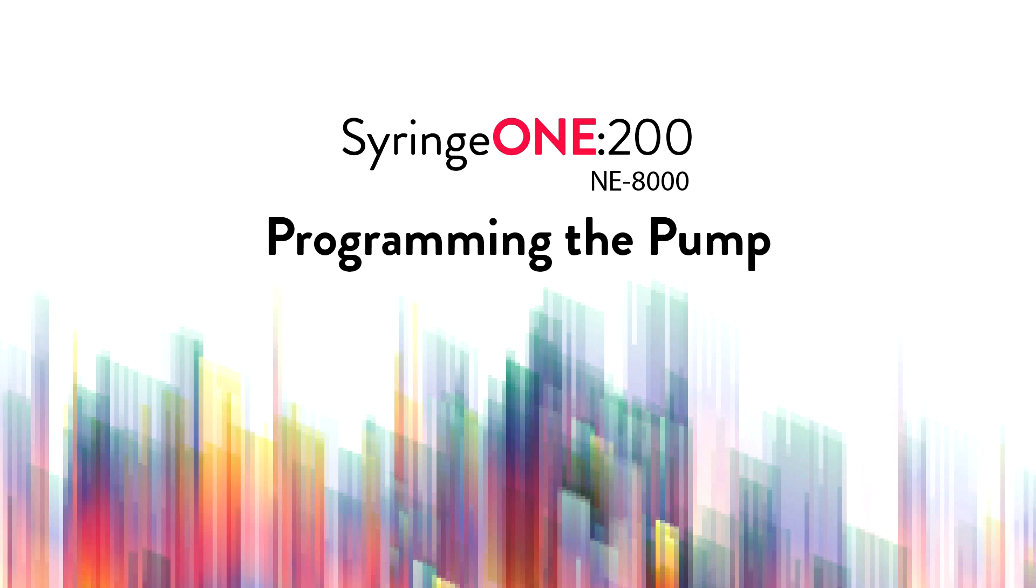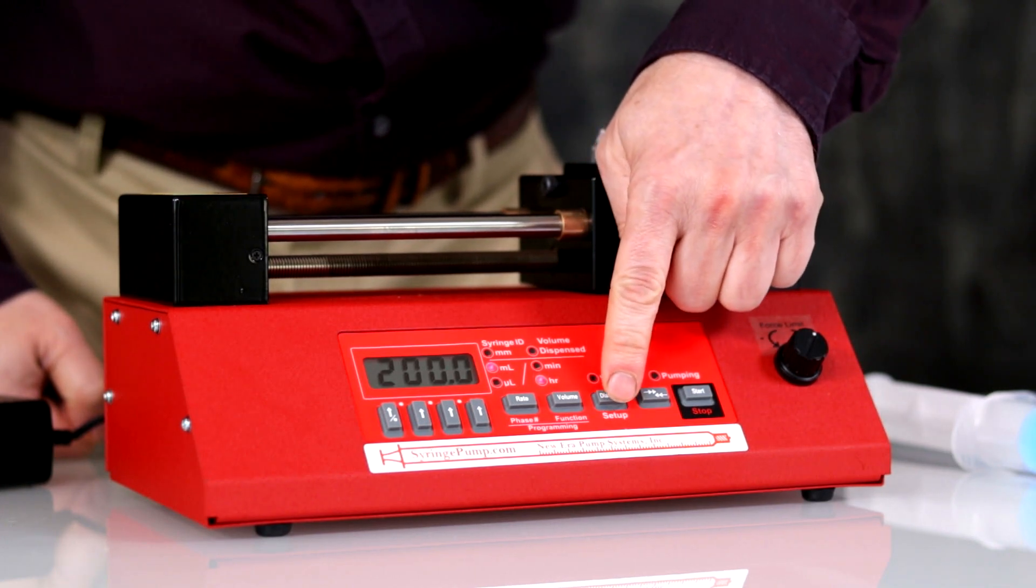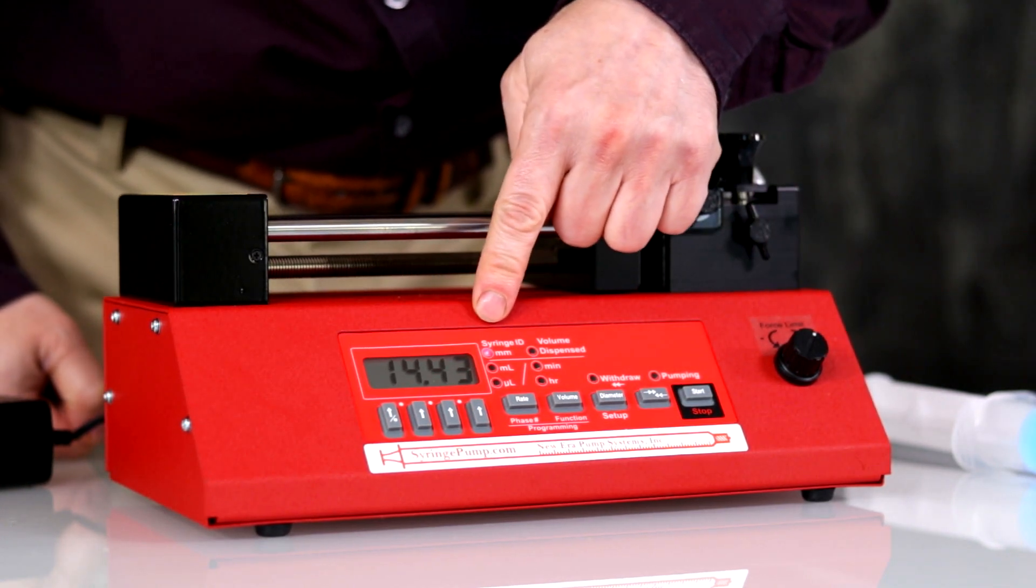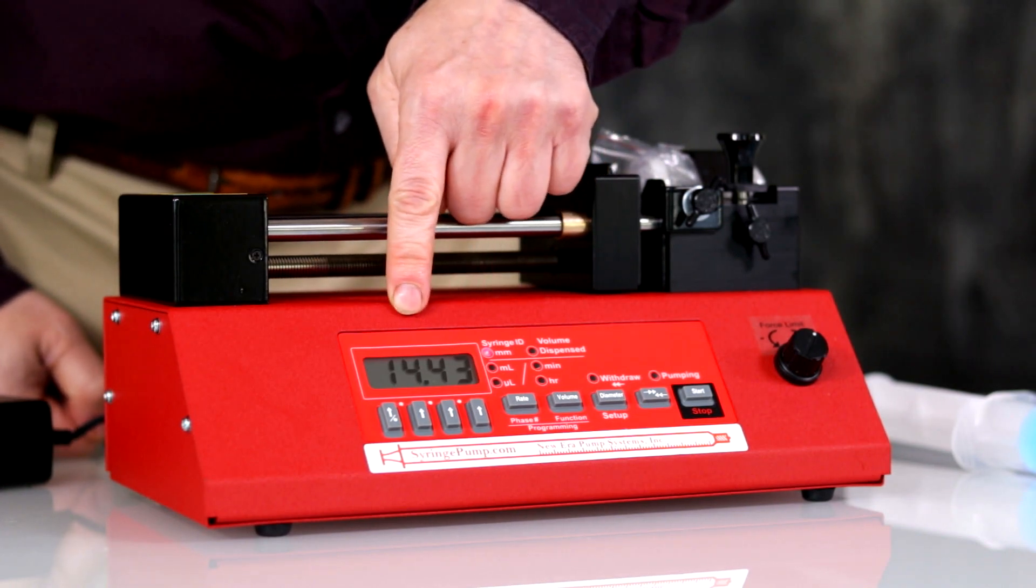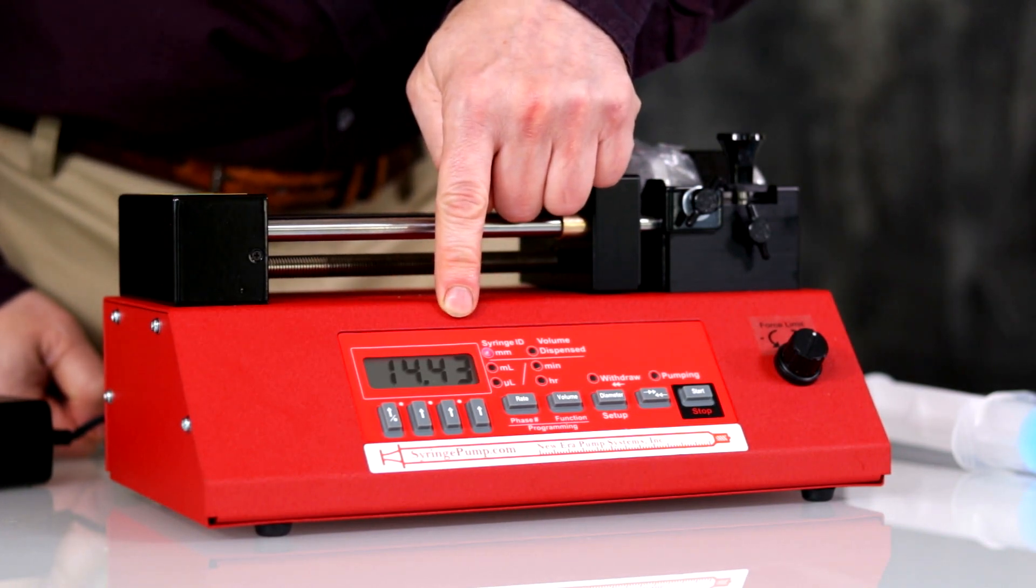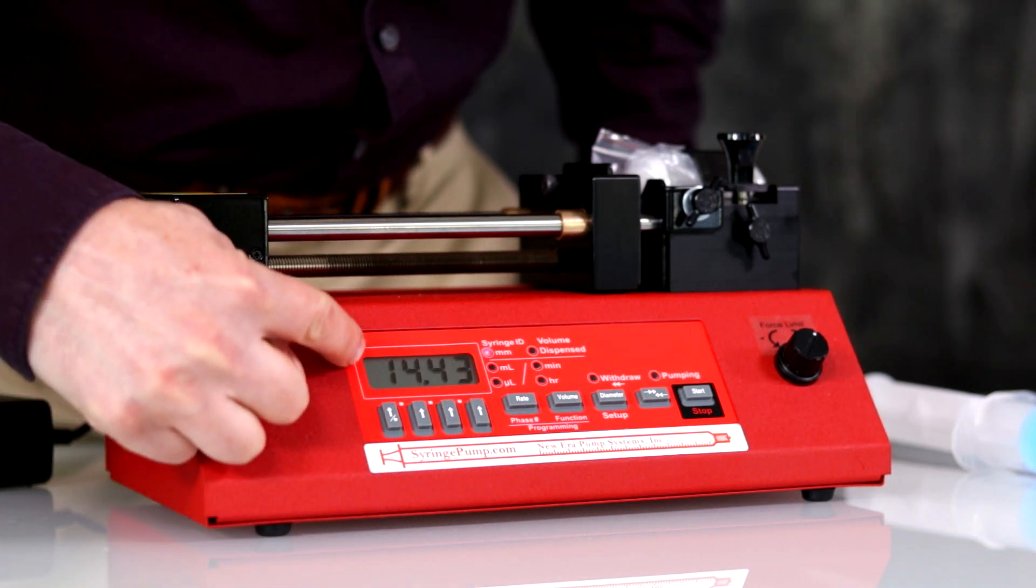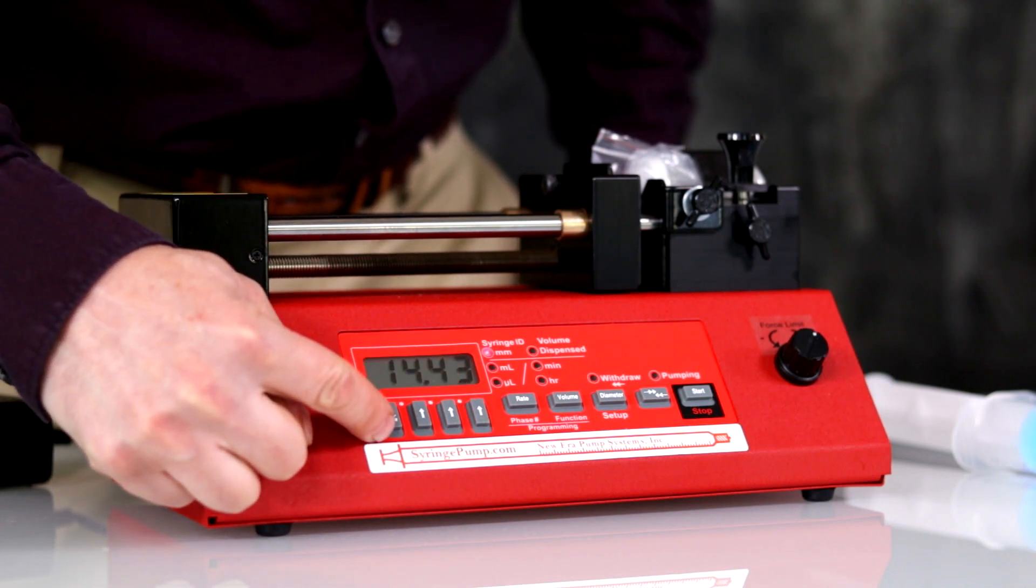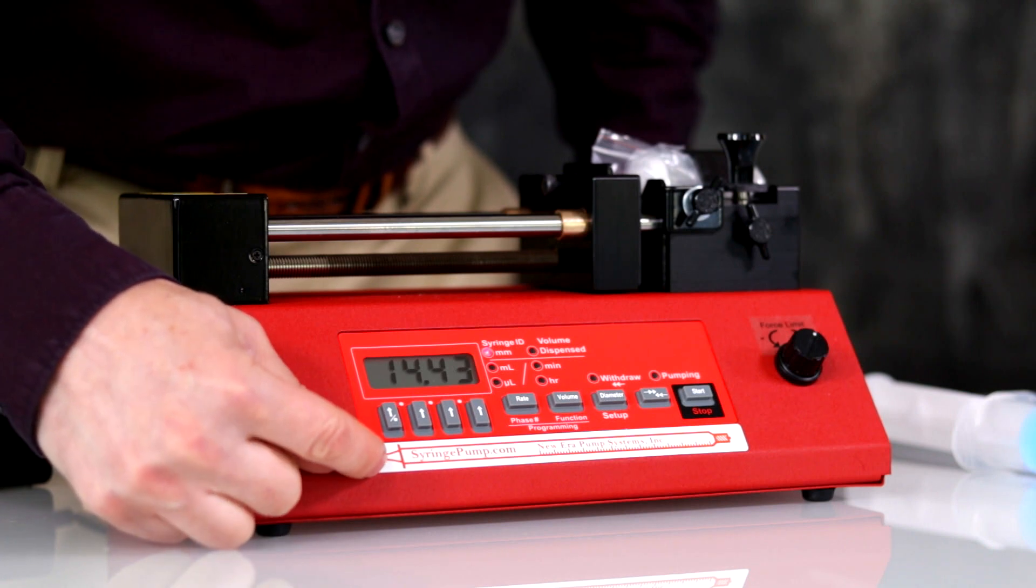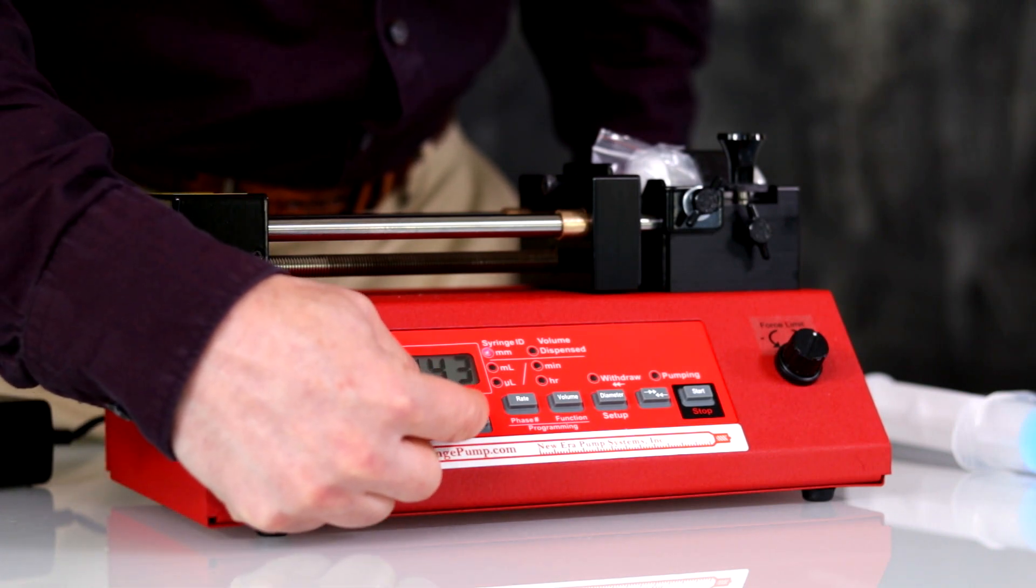NE-8000 programming the pump. To program the pump, first enter the syringe diameter. Press the diameter key. It will display the currently selected diameter, 14.43 millimeters, which is the factory default. To change, use the up arrow keys to increment individual digits. To set the decimal point, simultaneously press the two up arrow keys under where you want the decimal point to be. Press it again to clear the decimal point.